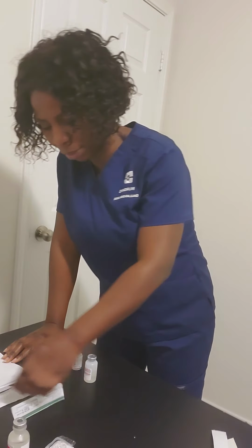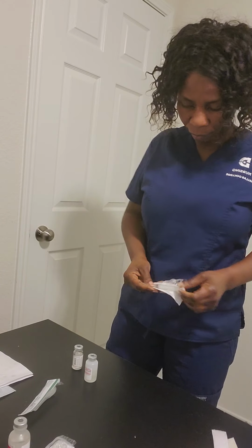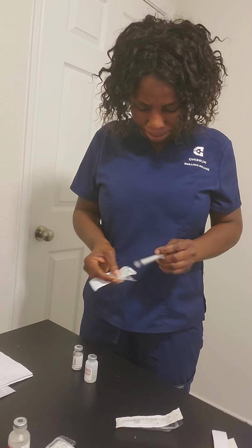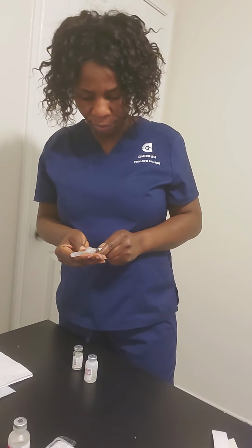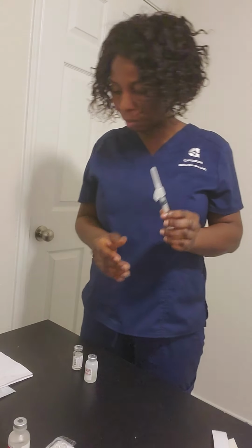I'm going to take my syringe and prepare. I'm going to fix a needle. I'm going to drop this in the trash. Just trying to take off the cap.